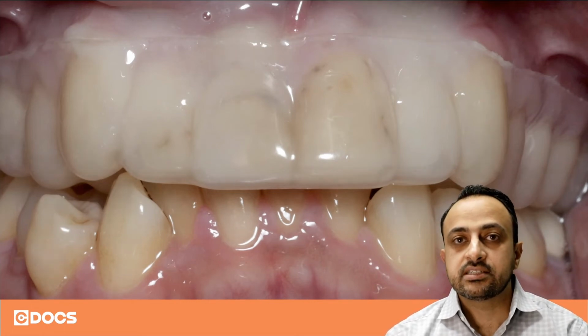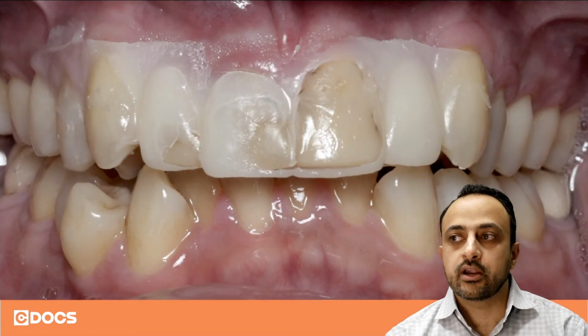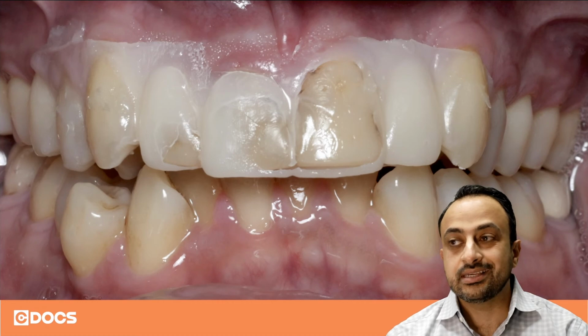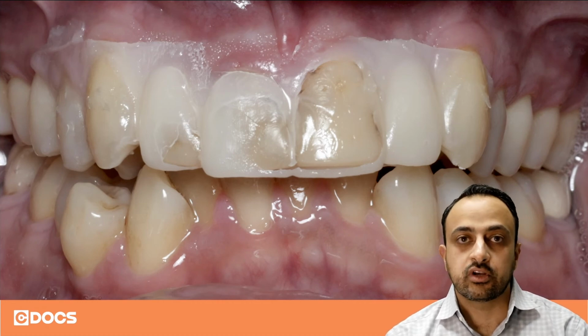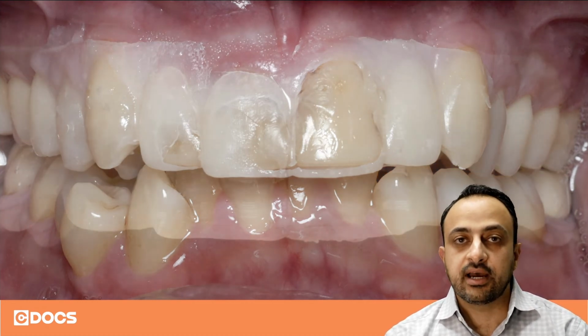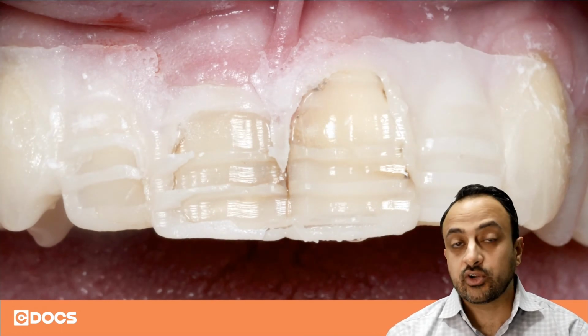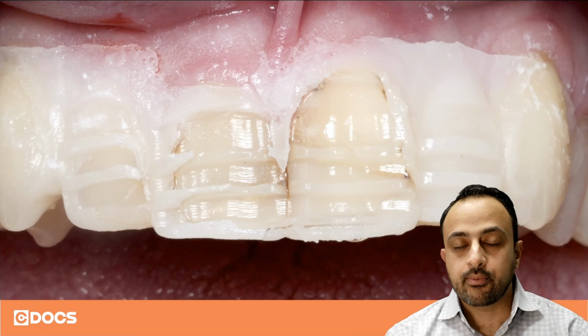What this does is it gives me a reference point of where the final restorations are going to be and where the current teeth are. So I can see exactly where it's going to be additive and where it's going to be subtractive. I simply take my depth cutting burs, make my depth cuts through the transferred bisacryl, and then I finish my preparations after that.